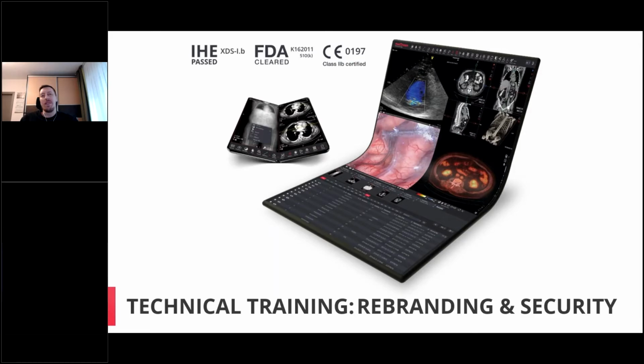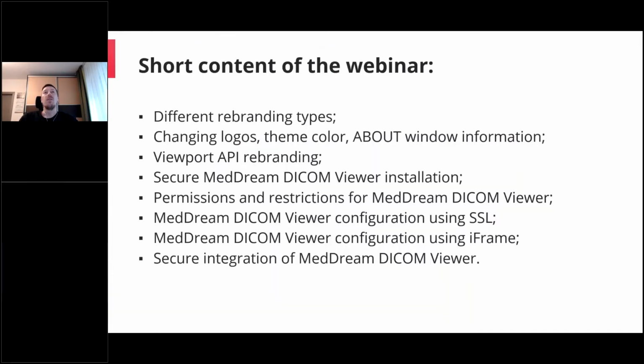So my name is Marius and I am a system integrator here at Softneta, and today we will talk about two topics, rebranding and security. So let's see a short agenda for this webinar.